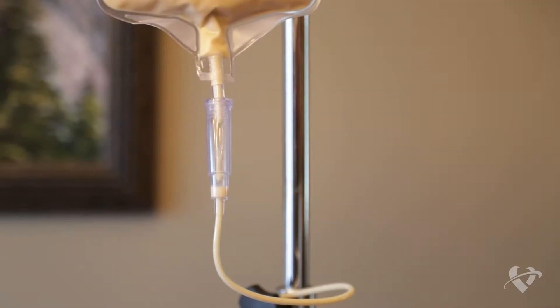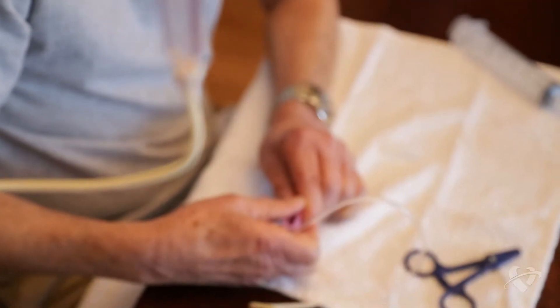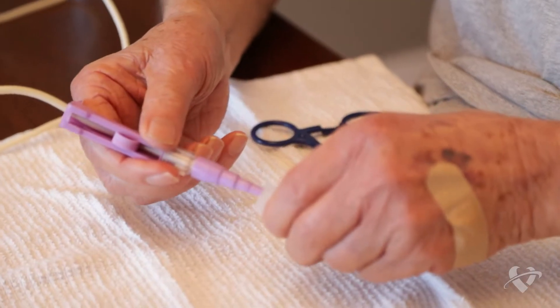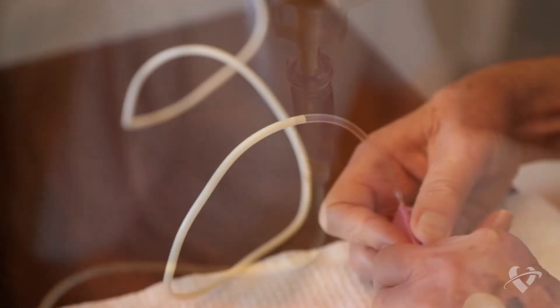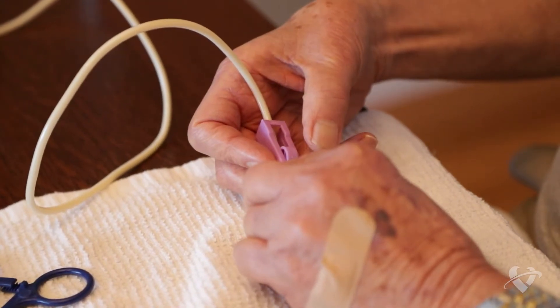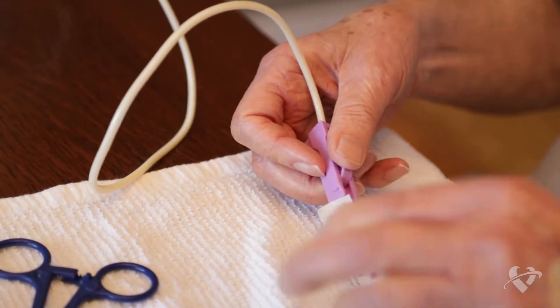Next, prime your feeding bag tube. This means you let the formula run through the tube to remove air before you feed yourself. Remove the cap from the end of the tube and slowly open the roller clamp. You will see the formula drip into the drip chamber and fill the tube. When the formula reaches the end of the tube, close the roller clamp to stop the flow.